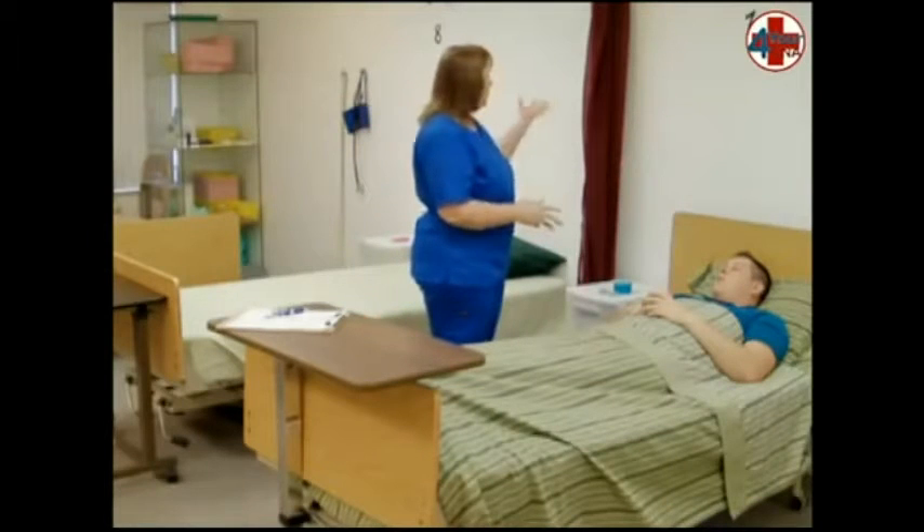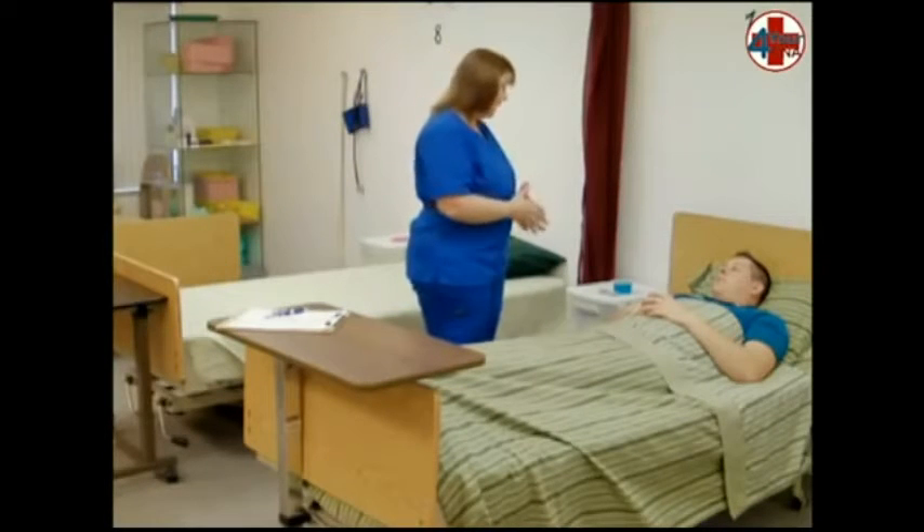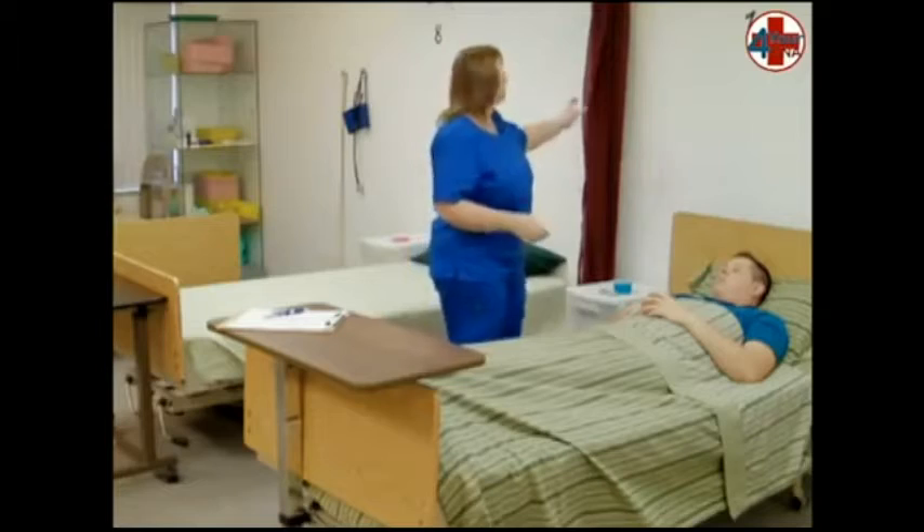Introduce yourself by name and title, describe what you will be doing, obtain permission, close the curtain, and wash your hands.